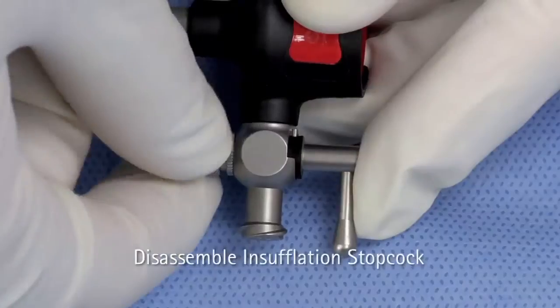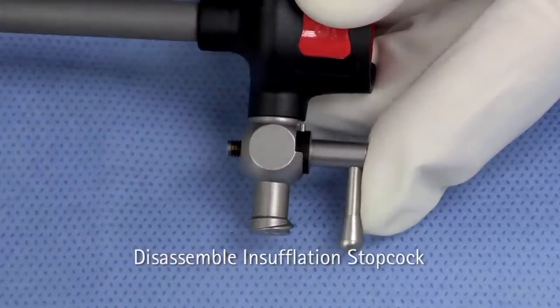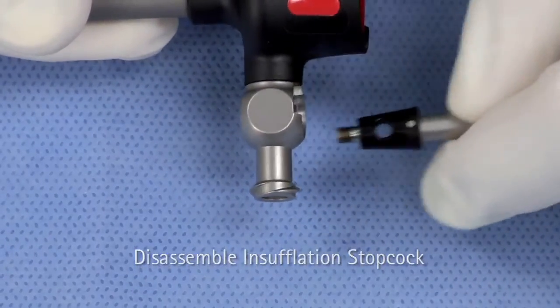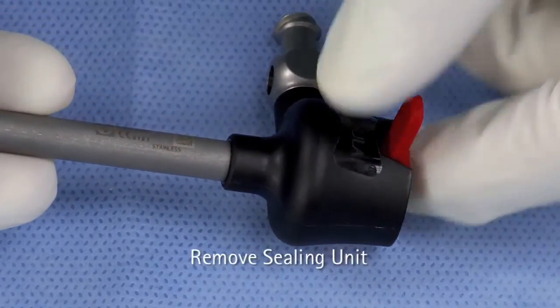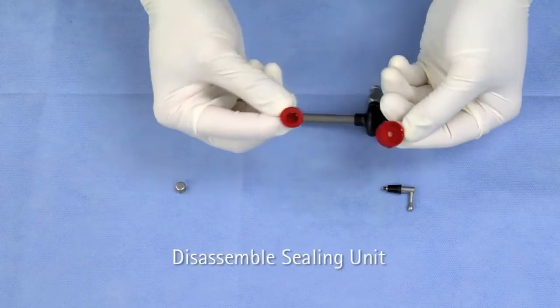For trocars with insufflation, unscrew the spring cap and remove the stopcock from the insufflation valve. Pull on the sealing unit tab to remove the sealing unit from the trocar sleeve. Remove the cross-slit valve from the bottom of the sealing cap.